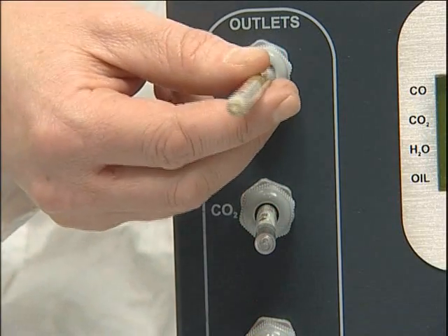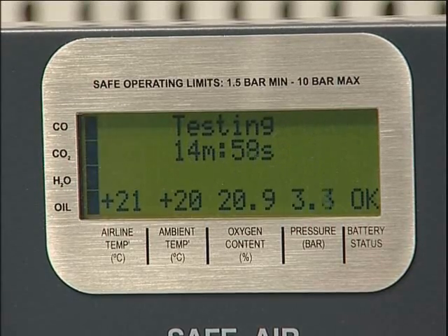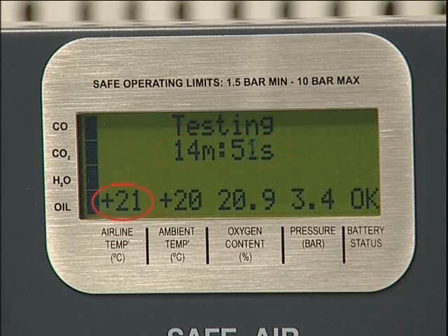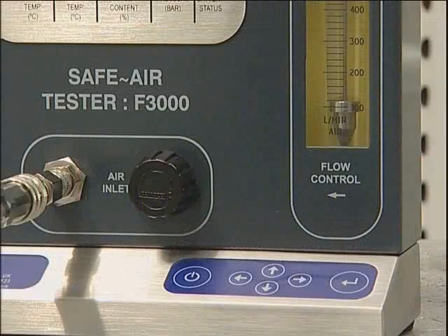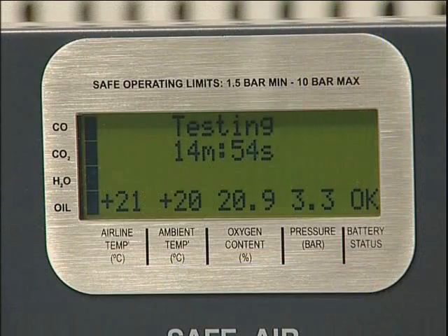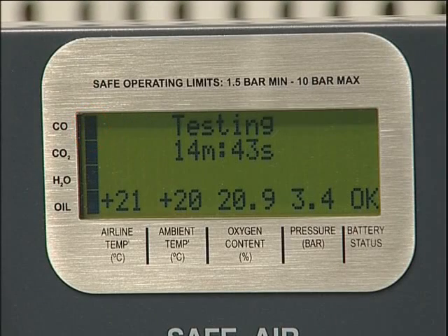Once all four tubes have been inserted, press enter to start the test. The duration will be displayed as a countdown together with airline temperature, ambient temperature, oxygen content and pressure. For airline systems during the test, the flow control valve should be set to the flow rate of the RPE being used. This will ensure the system is tested under the same conditions as it would normally be operating. The status of the individual tests is indicated on the left hand side of the display. Black indicates test active and clear indicates test completed.